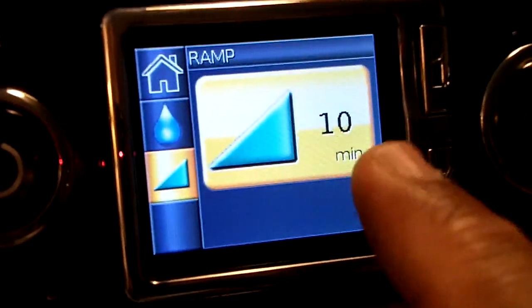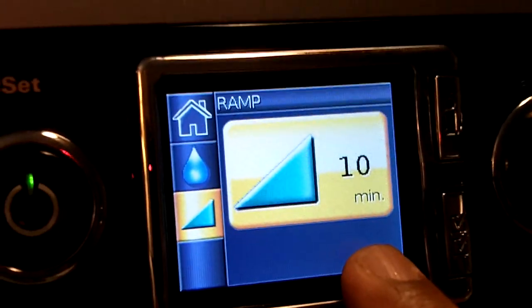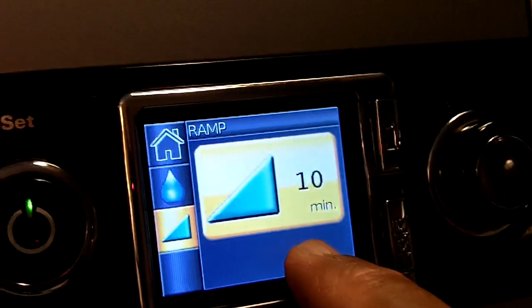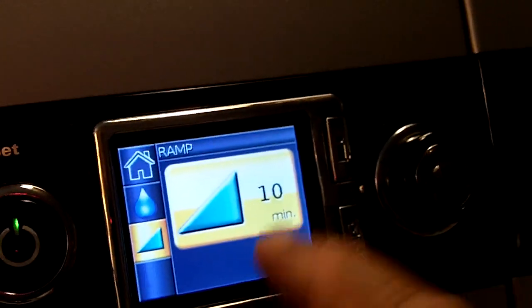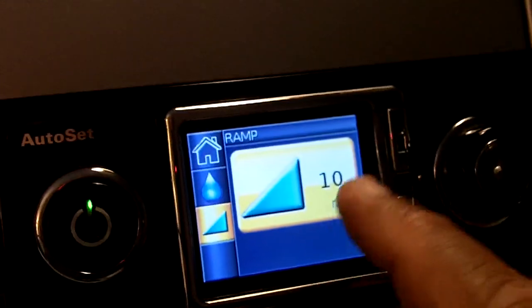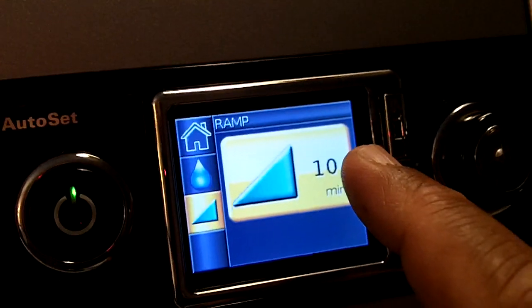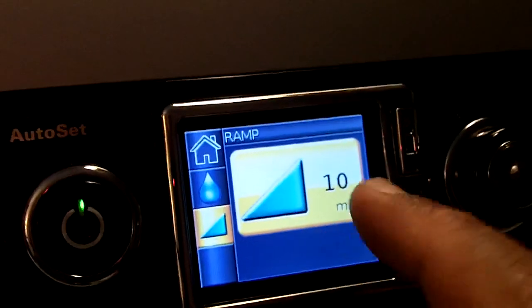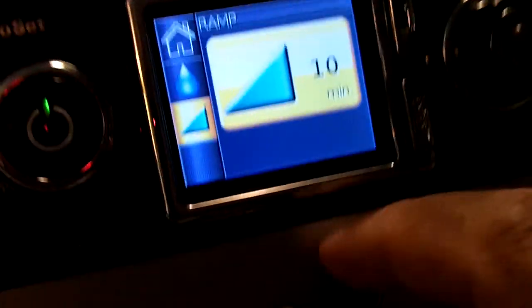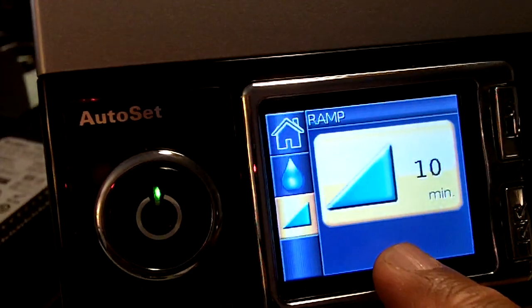The Resmed has that same feature, however, you cannot control it like I showed you here. You can only put it on and off. Once the home care company turns it on, it stays on, with the exception of if you're using a full face mask. Then for some reason the Auto On and Auto Off feature will not work in the Resmed. Okay, so there is a difference here.